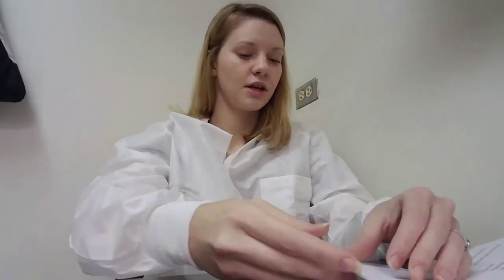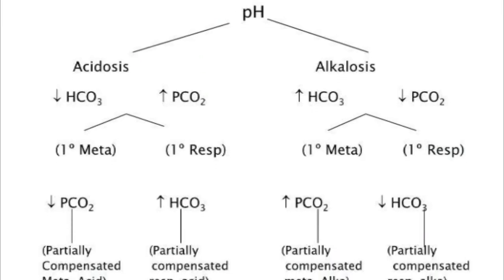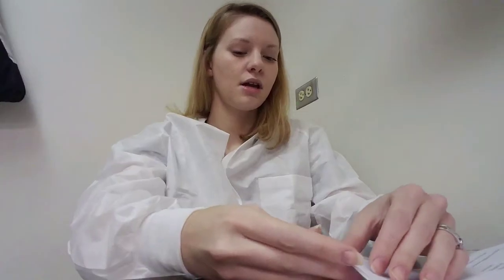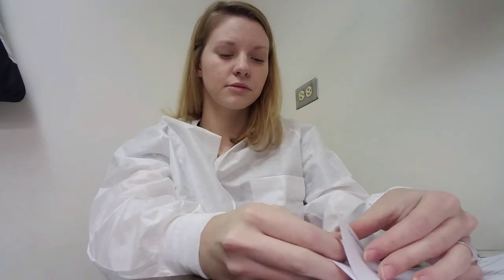And so then we'll go right down below that, and it's partially compensated respiratory acidosis. Make sure we're right. We have respiratory acidosis, and the reason is respiratory failure.